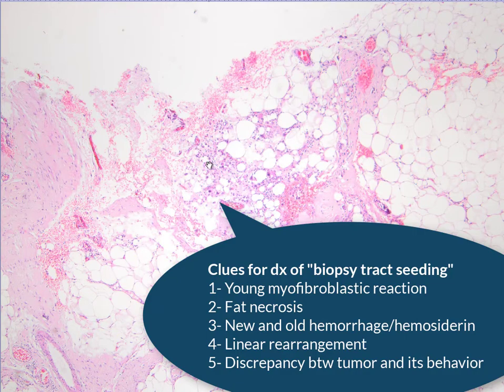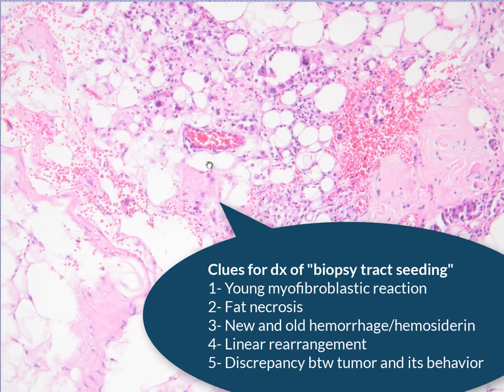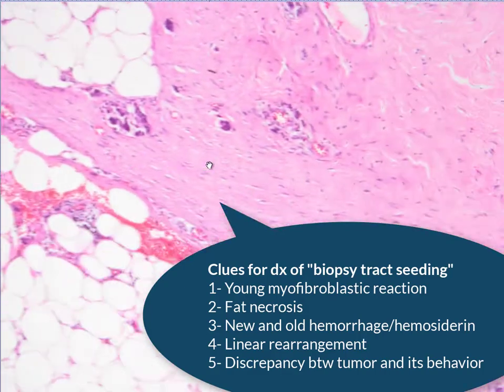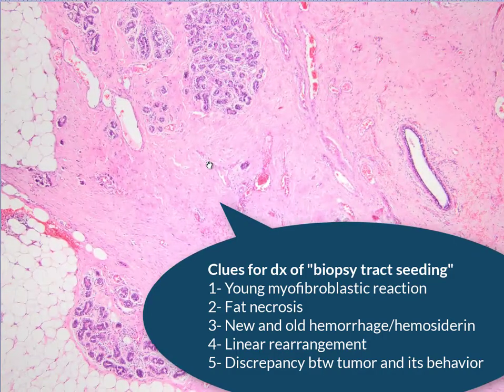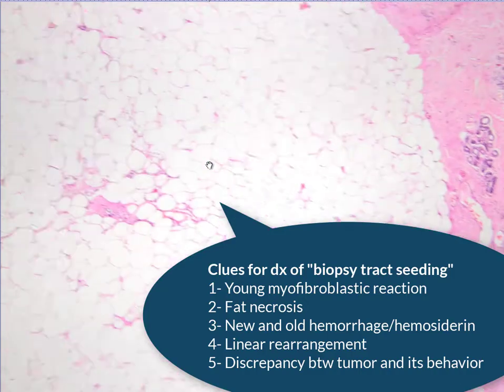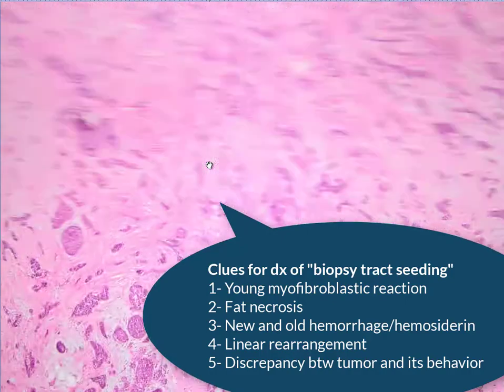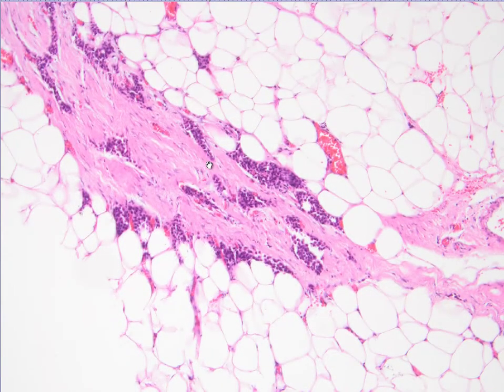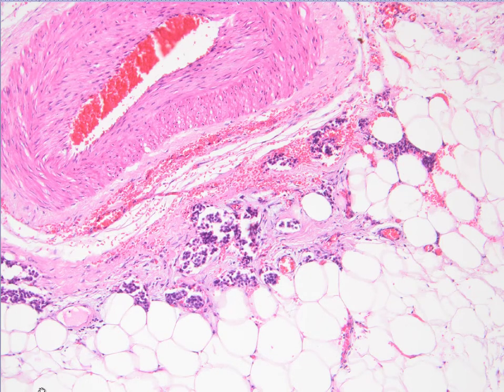Pathologists must be careful and collect information from accompanying morphological clues: you may find fat necrosis as seen here, or early young myofibroblastic proliferation. Also, lymphovascular invasion is not expected in this type of tumor. These are important clues in order to reach the correct diagnosis and ensure correct management of the patient. Thank you very much.